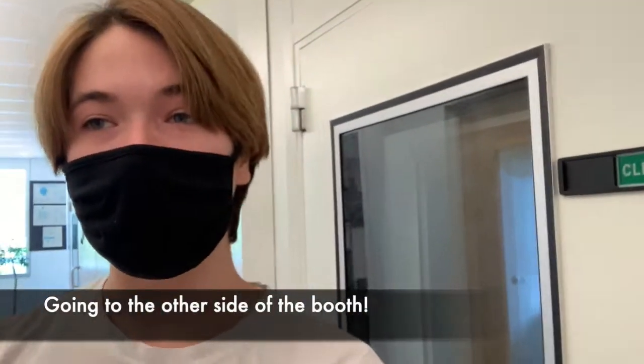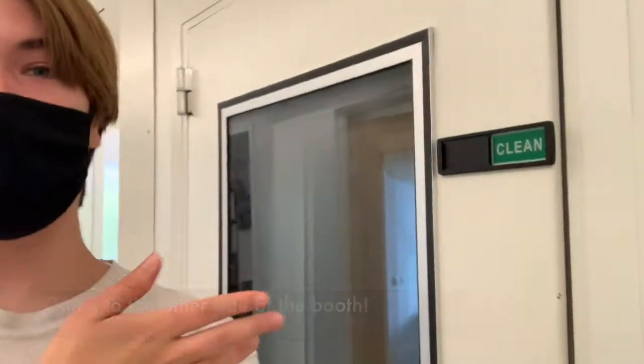Okay, once you've put your earphones or headphones on the client, you're going to walk around the booth, close the doors because the room is soundproofed. You don't want any sound getting in. You'll come around to the other side of the booth.